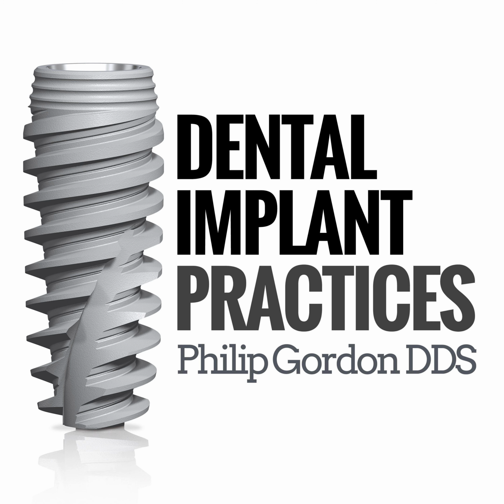And so what we do is we present the case, and if the patient says, okay, let's do it, then we'll go ahead and we'll do an optical scan so we can merge that data with the cone beam data for finalizing the plan, and for actually creating the surgical guide. So then the patient goes to the front desk, they talk to the implant coordinator, they select their surgery date, they put their 50% down, and at the end of the day or at lunchtime, I finalize the case, which takes about maybe 5 minutes, and upload the data to Germany to have a file created for the surgical guide.